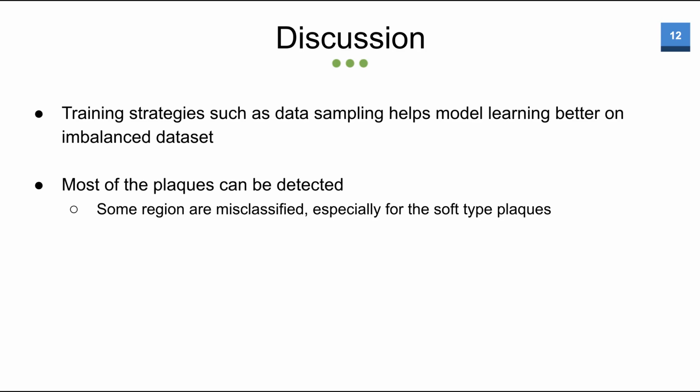From our result, we consider that this training strategy helps the model learn better on our imbalanced dataset, and our method successfully detects most of the plaques, but with some regions misclassified, especially for the soft plaque type.